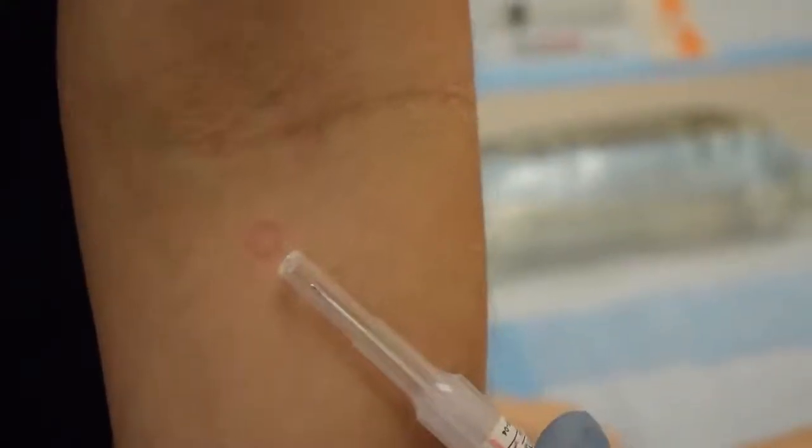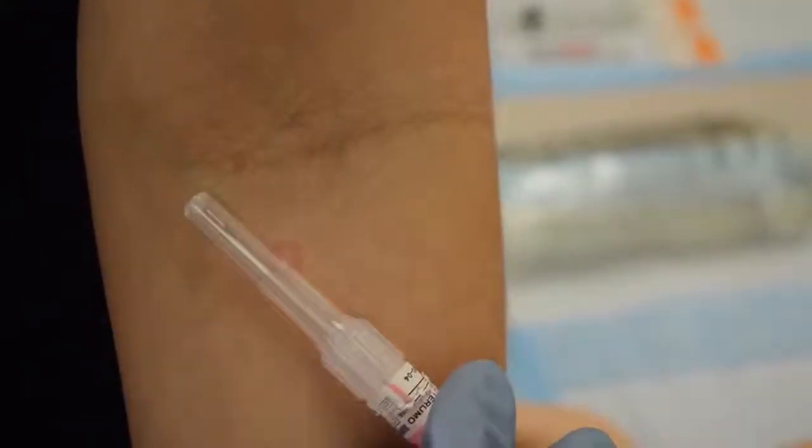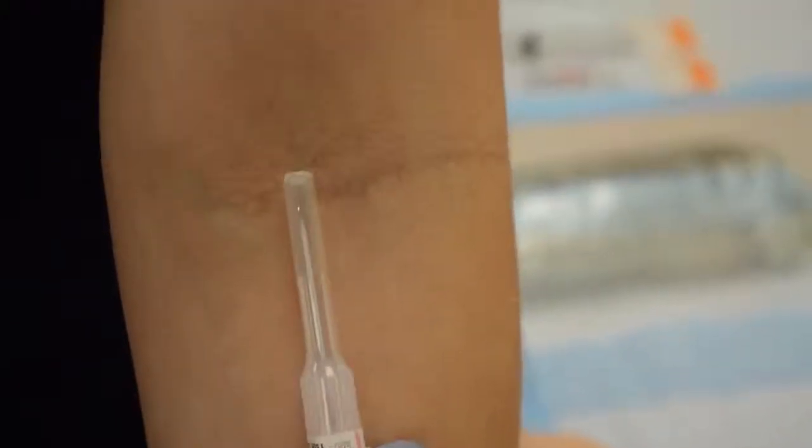So the direction of the vein is also very important. Not everyone's veins run up and down like the center vein does. Sometimes they run at an angle such as this. At that time, you want to make sure that you are appropriately aiming your catheter, whether you're aiming here at an angle or here straight forward.